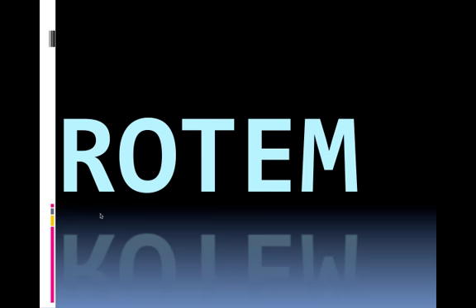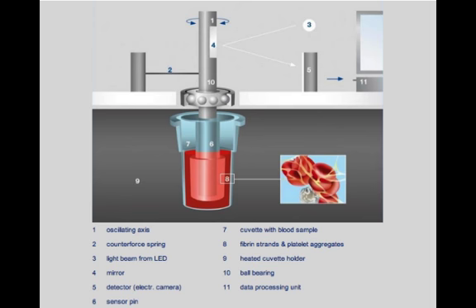We're going to be going over thromboelastography, or TEG, as it is sometimes called. But more specifically, we're going to be going over the device we use at our facility here, which is the ROTEM device. Essentially, the difference between these two devices is the part that spins. With the TEG, the cuvette is what spins, which is the cup where the blood is added to. With the ROTEM device, it is the spindle that is dipped down into the blood and then spins back and forth and oscillates.